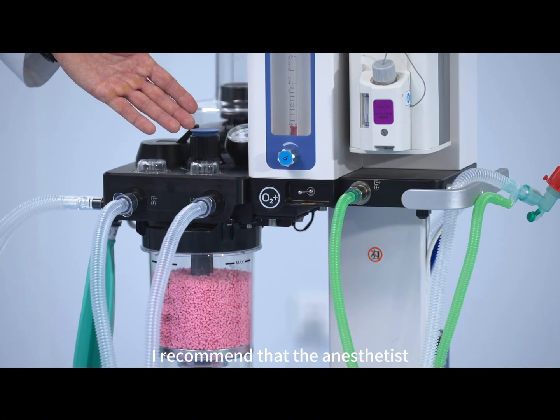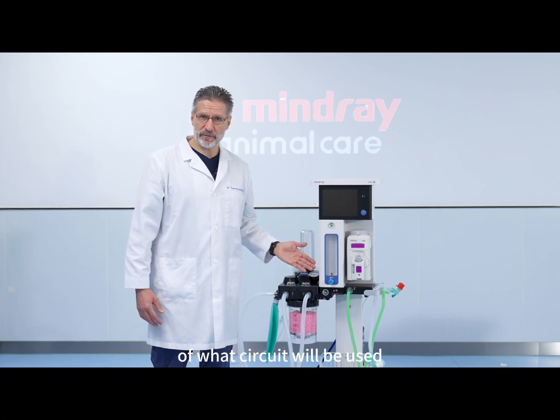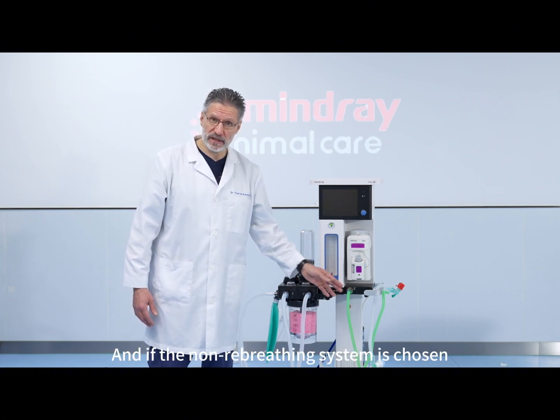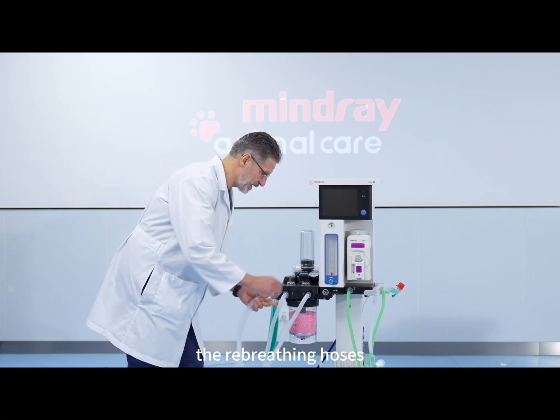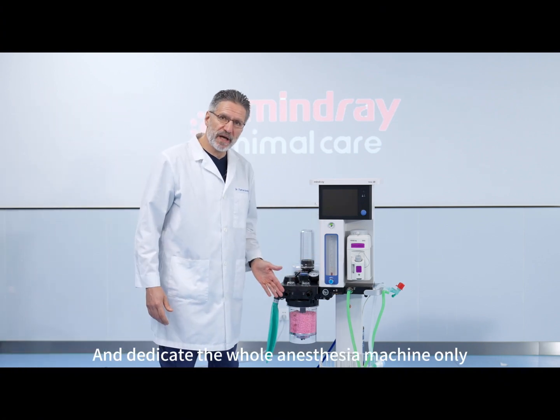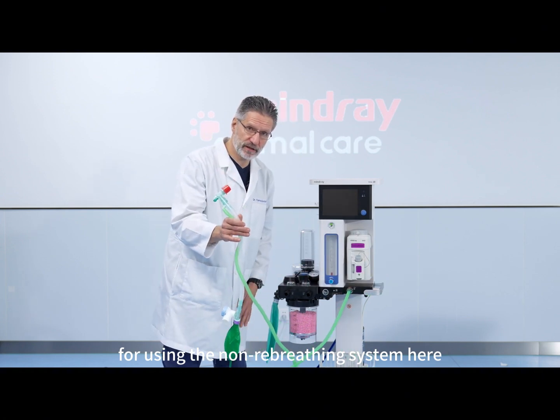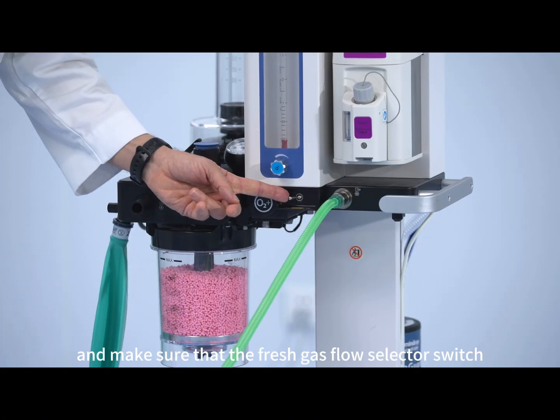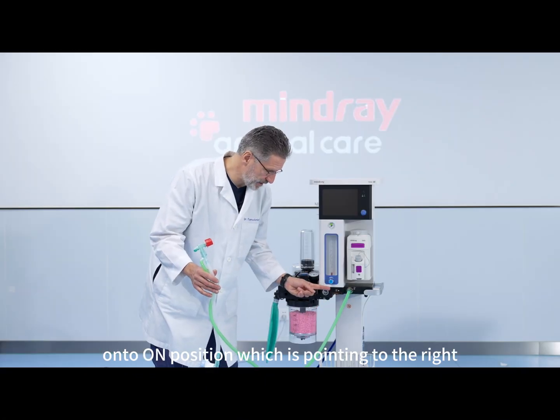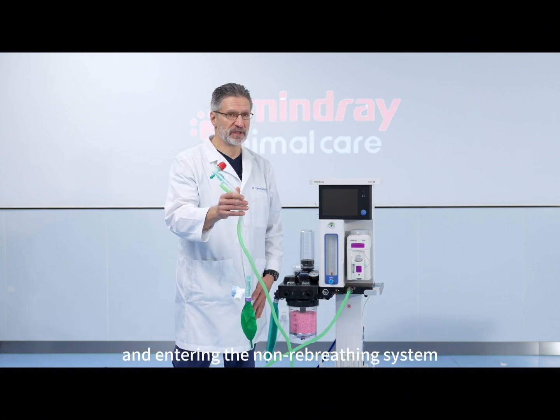I recommend that the anesthetist makes up their mind about which circuit will be used for the anesthetic procedure. If the non-rebreathing system is chosen, then simply remove the rebreathing hoses from the system, and dedicate the whole anesthesia machine only for using the non-rebreathing system. Make sure that the fresh gas flow selector switch is turned to the on position, pointing to the right, so the fresh gas is exiting this port and entering the non-rebreathing system.